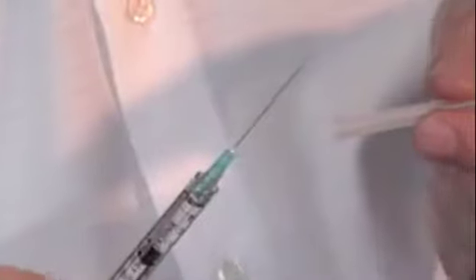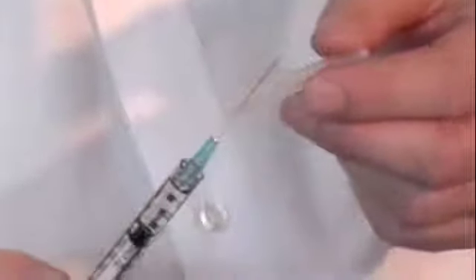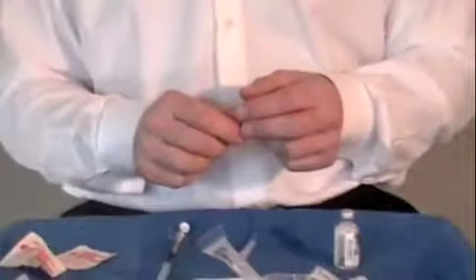Now that we have our 25 gauge needle attached, we're going to remove any air that's in the syringe by depressing the plunger. You can see how the air bubble is no longer there. You can then recap the needle. This will keep it sterile. You may set it down as you prepare the injection site.